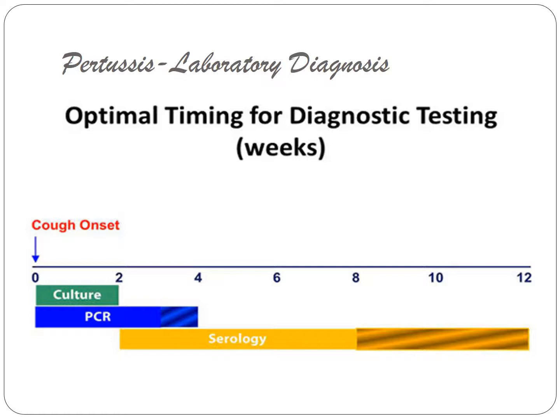Because of the increased sensitivity and faster reporting of results of PCR, many laboratories are now using this method. However, PCR should be used in addition to and not as a replacement for culture. PCR is less affected by prior antibiotic therapy, since the organism does not need to be viable to be positive by PCR. Nevertheless, continued use of culture is essential for the confirmation of PCR results.